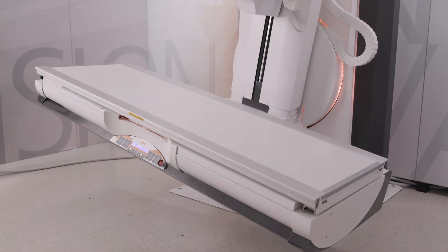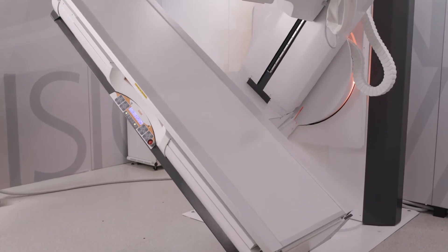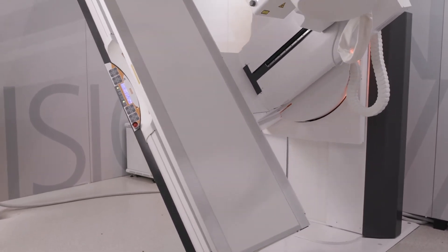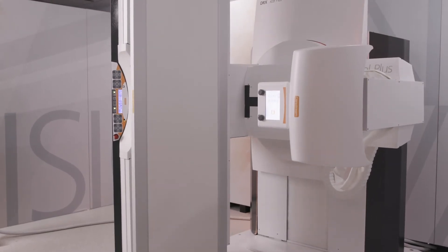The system offers motorized table tilting, ranging from negative 90 degrees to positive 90 degrees, which means the table can be tilted to the upright position in either direction, giving you the highest level of flexibility.